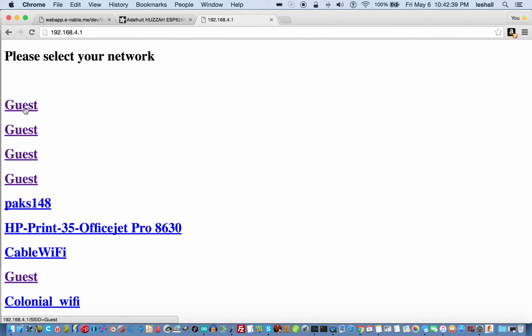Okay, now we're showing guests. When it does a network scan, it lists all the devices and all of the access points, and the SSID for the devices is the same as the access point. Kind of weird. But anyway, you pick one. I've got to add code to make this just be one. That shows up one time, but anyway. Alright, click.